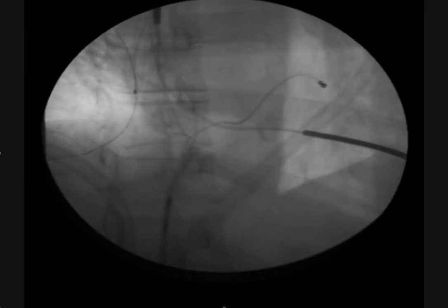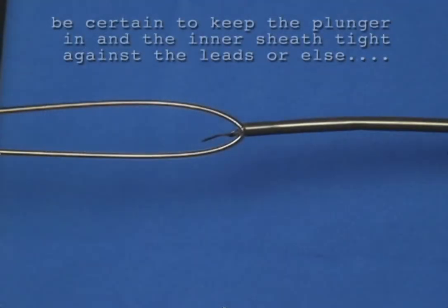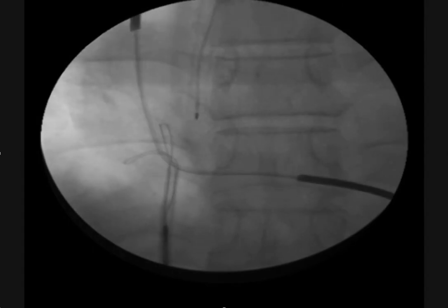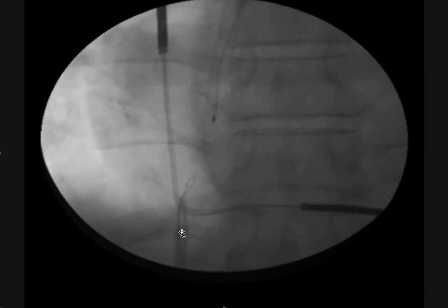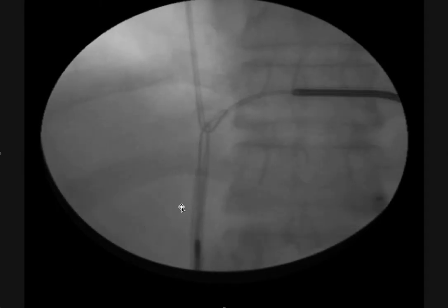And here's another one, and this is all going fine. And this time, I had it all locked up tight. And you can see the inner sheath here, the threader loop, the loop, everything's going great. And now look what happened. I allowed the inner sheath to slide back. I didn't put the Kelly clamp on there. And see how much further. So this is sliding back because I didn't put the Kelly clamp there.